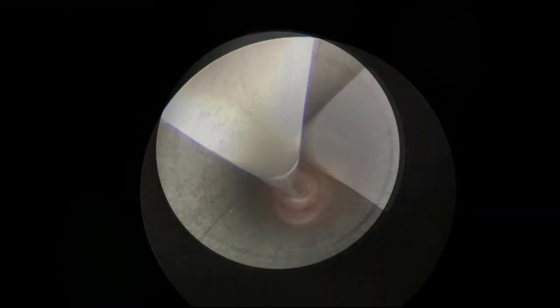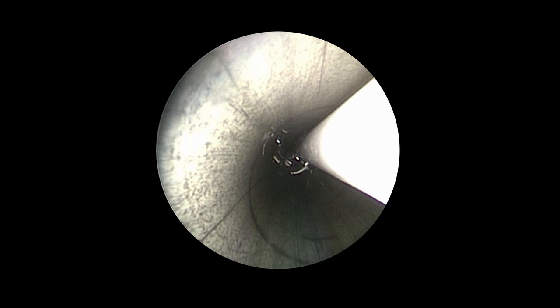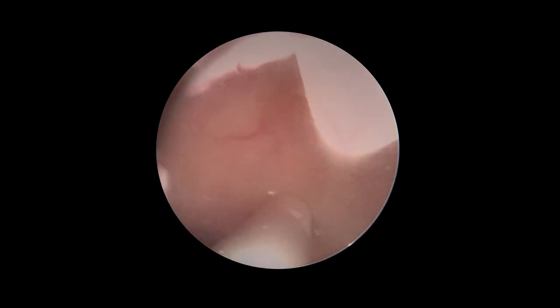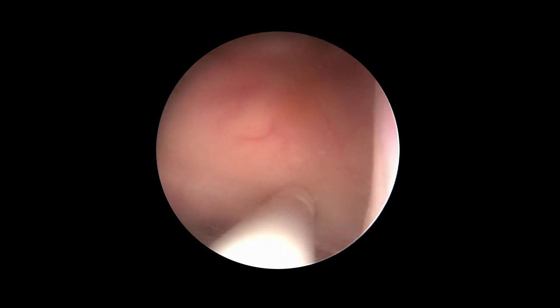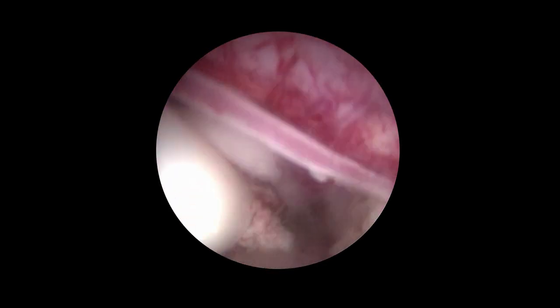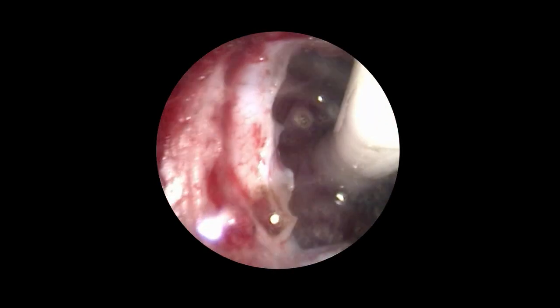After placement of the stent, the endoscope sheath is carefully removed. In order to ensure that the stent is not dislocated when removing the endoscope sheath, the inspection is performed with the thin 0 degree endoscope through the cortical puncture channel along the stent. To prevent stent migration, at the end of the operation the stent is fixed to a burrhole reservoir.